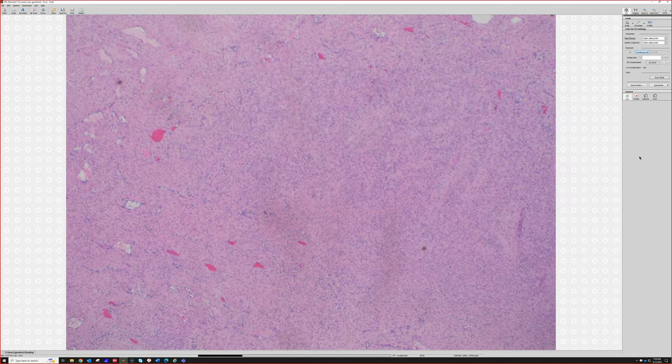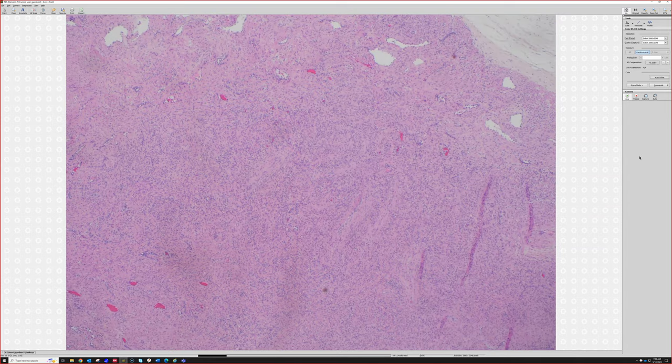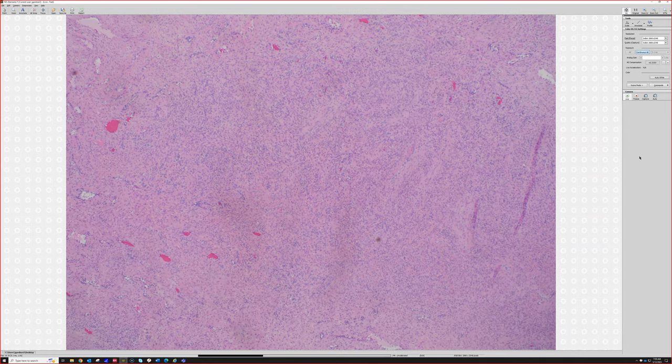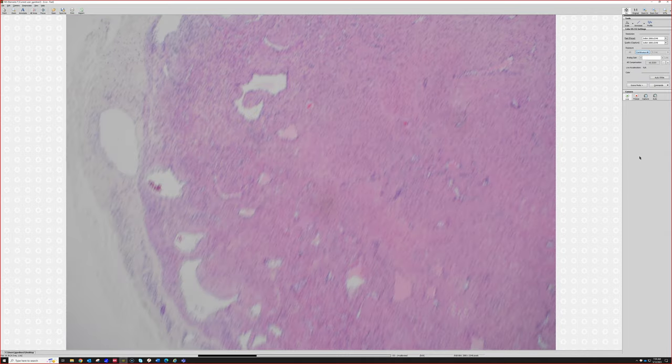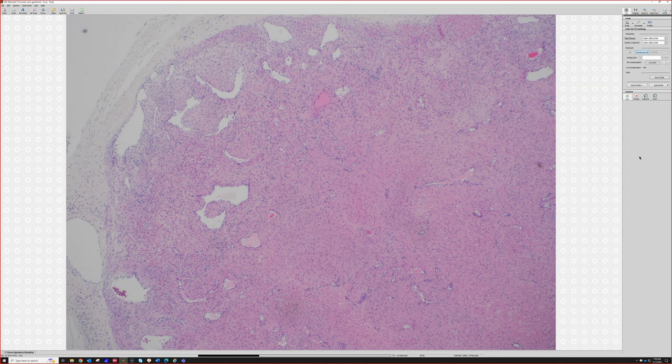And so this one is an interesting one because it has areas like this that look quite nice for myopericytoma. But then areas over here that look more like angioleiomyoma. And I have seen this occasionally before where you have this kind of overlapping tumor. And the thing is, they're benign. So it doesn't matter really if you call it angioleiomyoma or myopericytoma, or you say it's a spindle cell tumor with features of both. In the grand scheme of things, it doesn't matter because they're both benign and simple excision should usually be curative. So not a big deal.